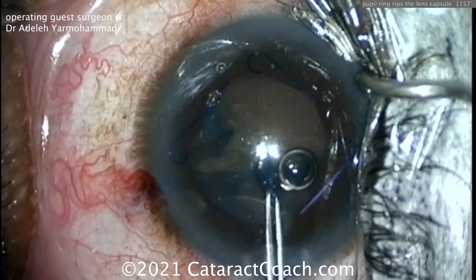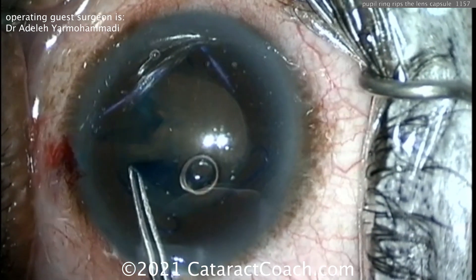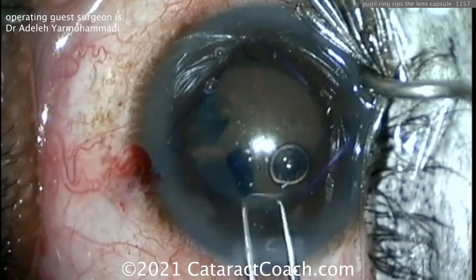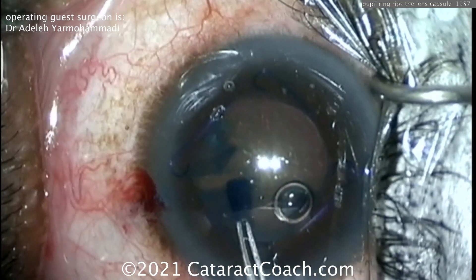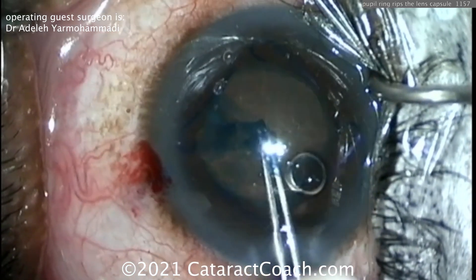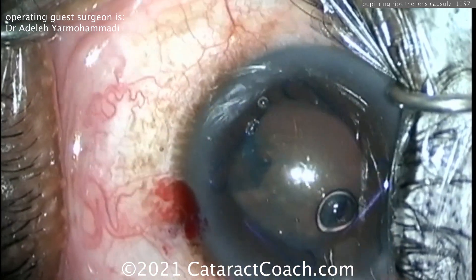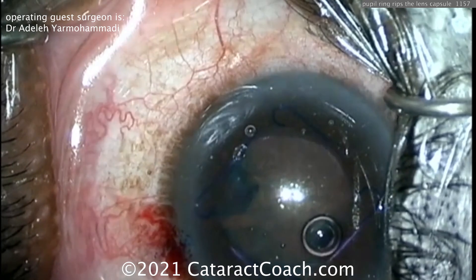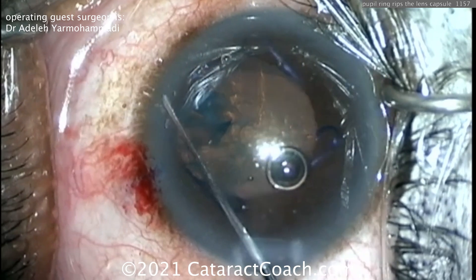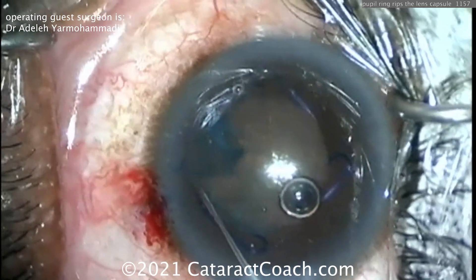Who can you blame for the complication? No one, really. Part of it may be technique, part may be the device, part may be the patient's weaker anatomy — you don't know. The blame game is useless; instead figure out how to recover and successfully complete the case. This case will go beautifully as long as you're careful not to put pressure on that run-out area and the little extra tab or flap of capsule tissue, which you can cut out with those same micro scissors.